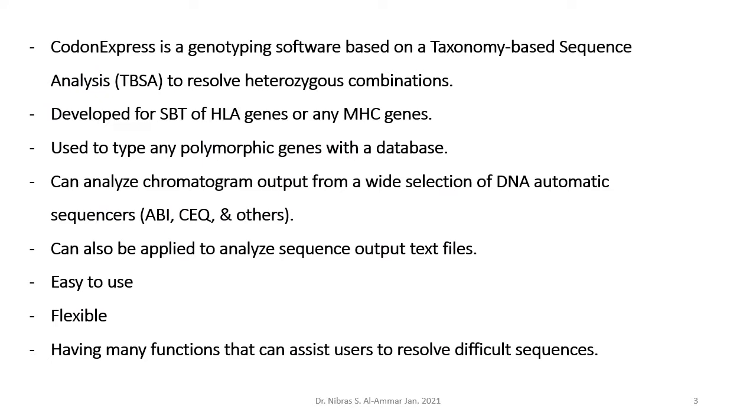Now, Codon Express is a genotyping software based on taxonomy-based sequence analysis, TBSA, to resolve heterozygous combinations. Developed for sequence-based typing, SBT, of HLA genes or any MHC genes. I mean any major histocompatibility complex genes. It's used to type any polymorphic gene with a database.